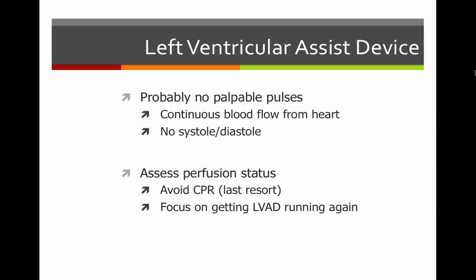The older generation devices do create pulses. Again, this is a bridging device. Patients aren't on these devices for long periods of time. So those older generation devices have gone away, replaced by the newer generations that are continuous.